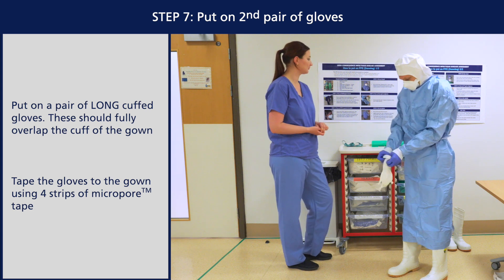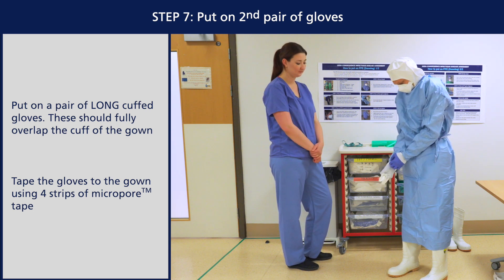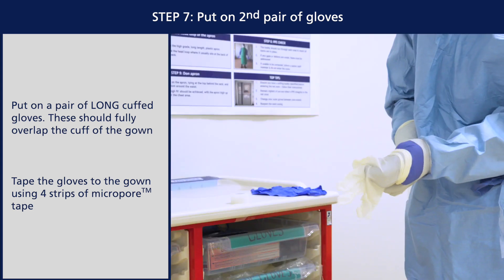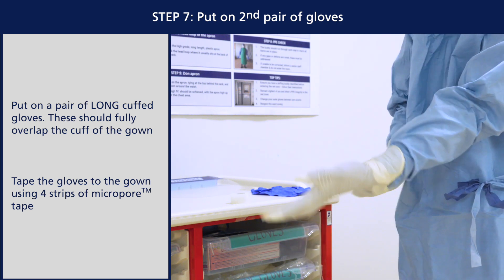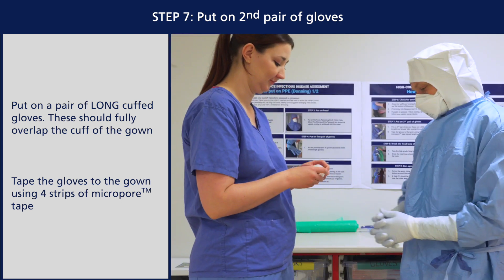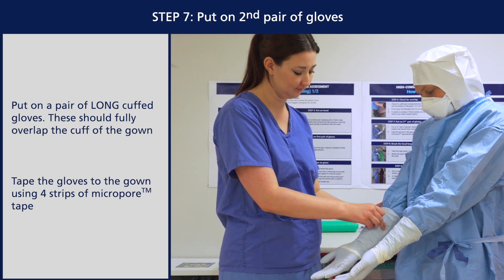Put on a pair of long cuffed gloves. These should fully overlap the cuff of the gown. Tape the gloves to the gown using four strips of micropore tape placed lengthways.